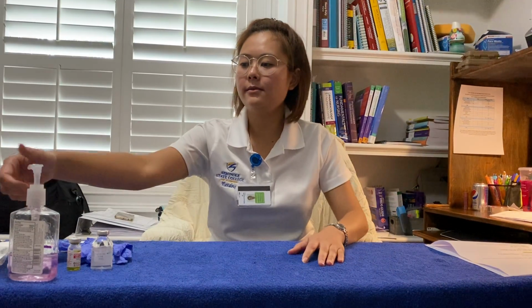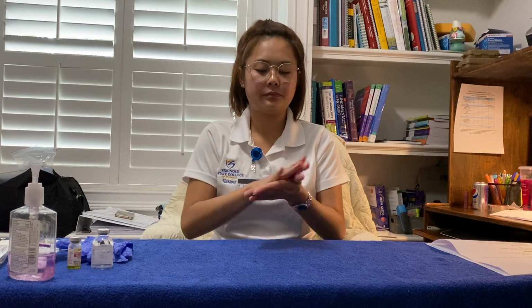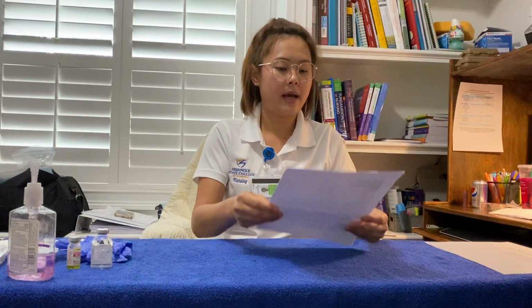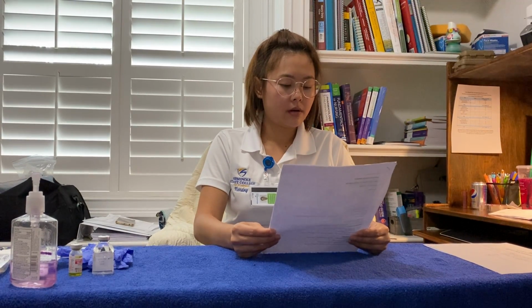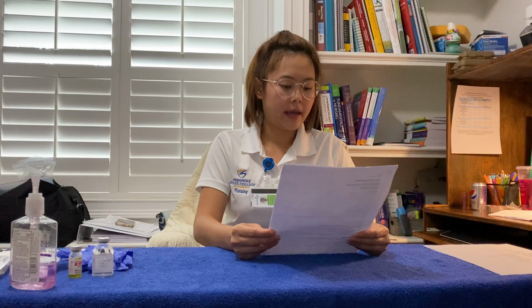Okay, so I'm going to start my procedure right now. First, I'm going to sanitize my hand, and then look at my medical records. Okay, I have my patient Anna Pawlowski, date of birth May 5th, 1957, and then I check my doctor's order. So I have a doctor's order for Anna.